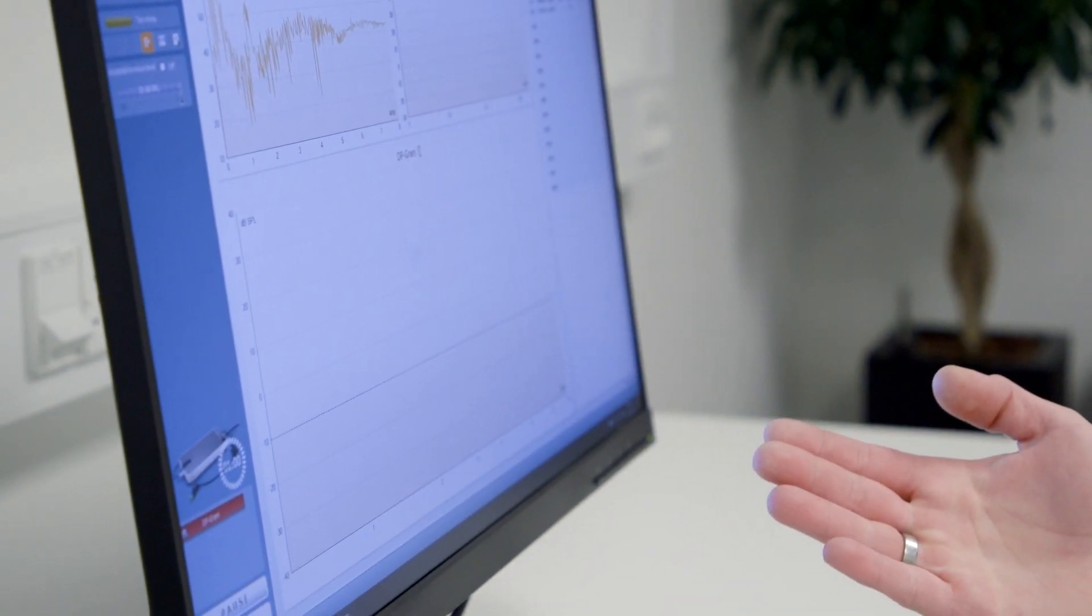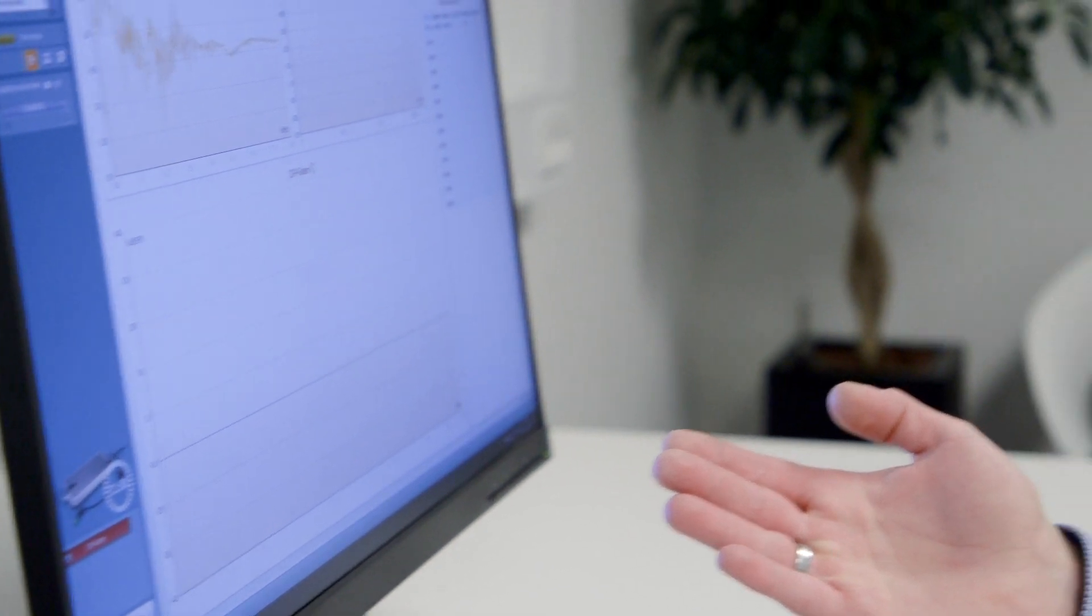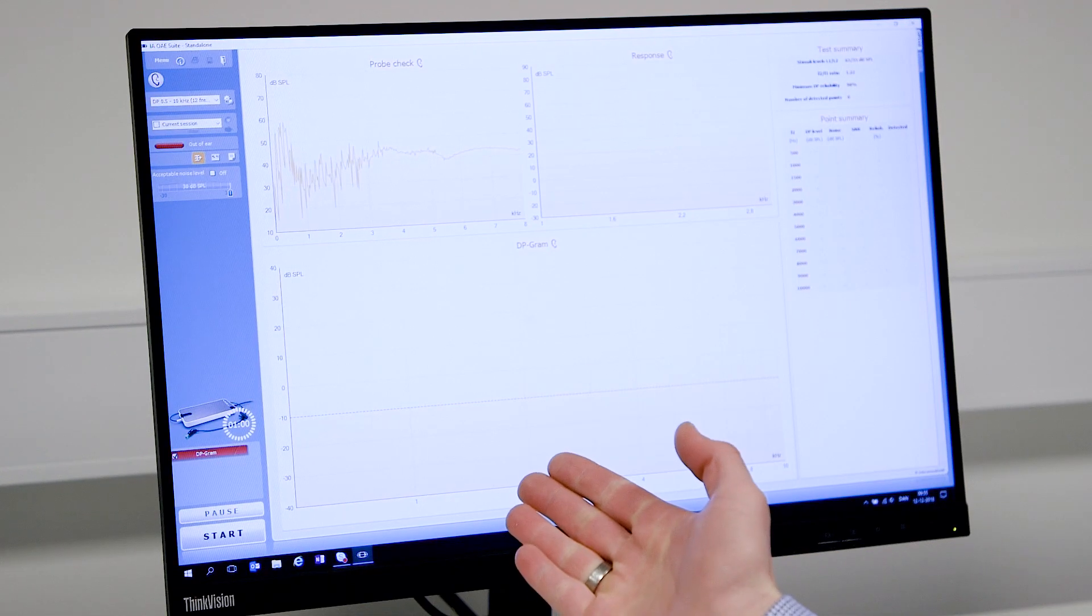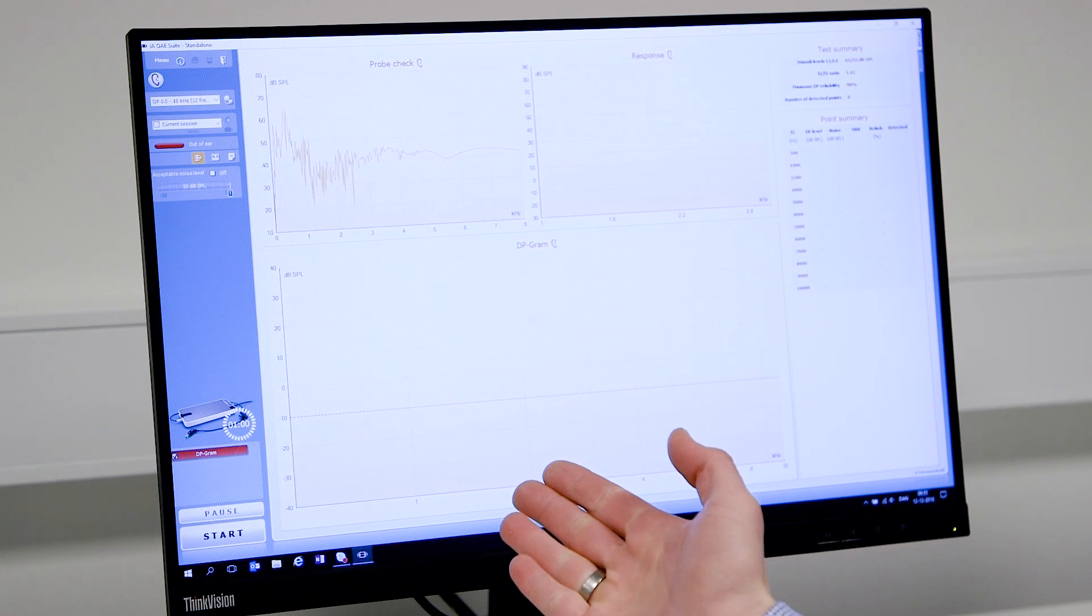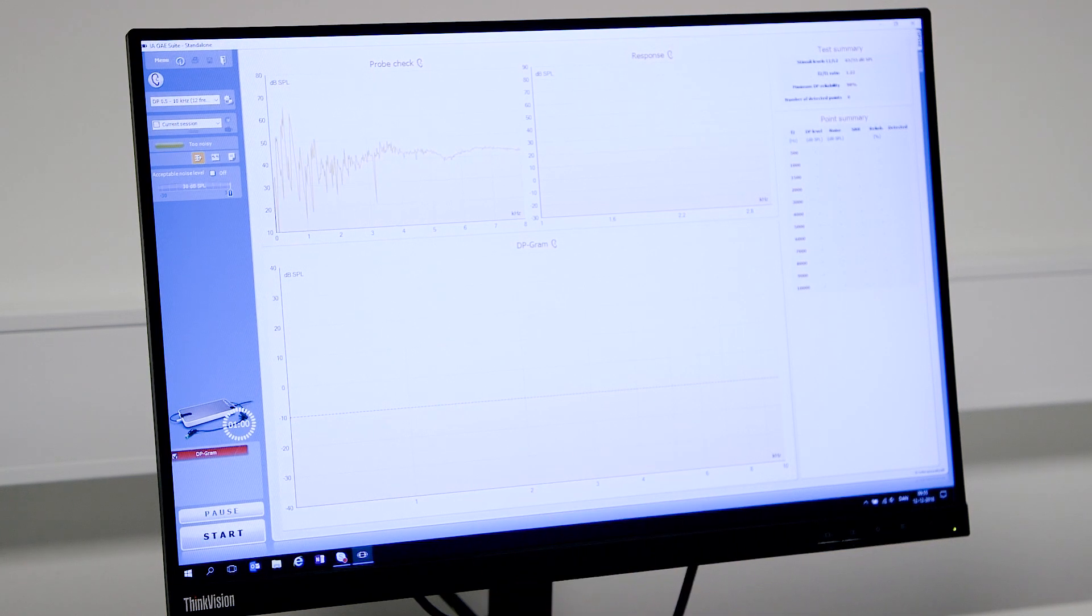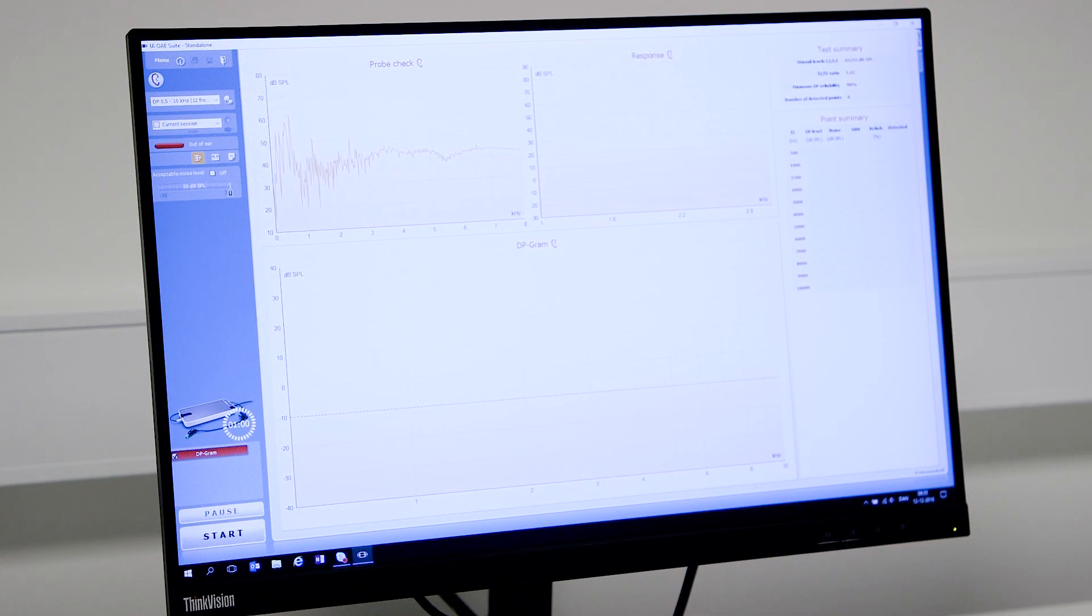The software, the IA OAE Suite, has an intuitive and user-friendly user interface. Many end-users will be able to see the similarity to the Titan Suite. The OAE measurements are also built on the OAEs from Titan, meaning that the Lyra offers well-tested and well-documented OAEs.